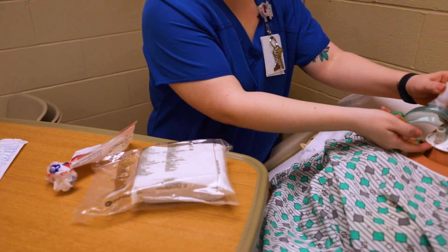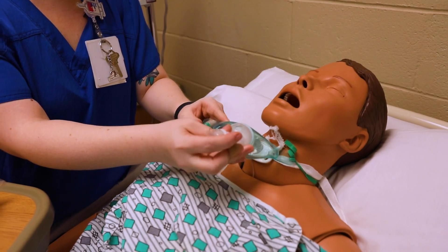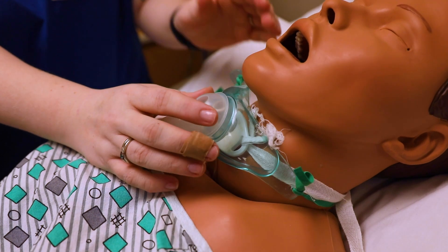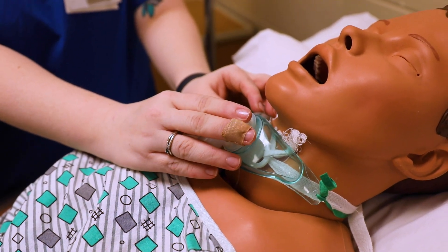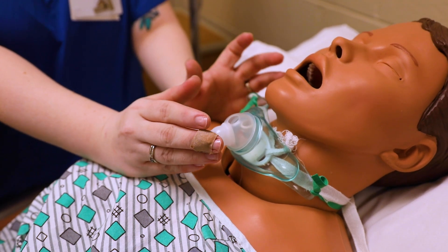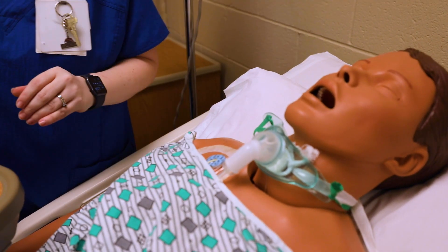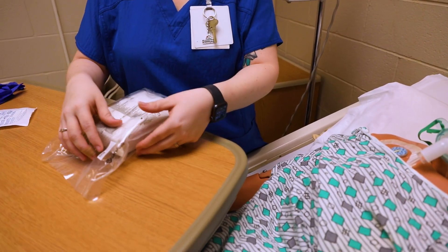Think about where that trach tubing is — it's going straight into that airway. This is called a tracheostomy oxygen mask; it's specific for tracheostomy. I'm going to have it on my patient, and here you're going to do what's called hyperoxygenation — I'm going to turn the oxygen up to 100% for a minute or so, depending on what your policy requires.